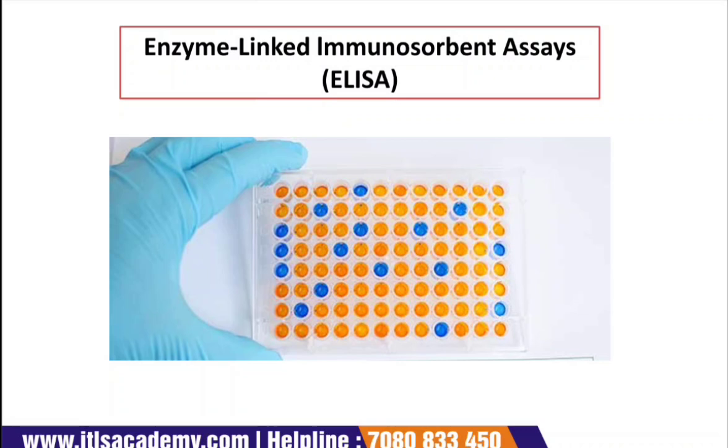By binding antibodies to the allergen and then using an enzyme linked conjugate to create a colorimetric change that can be measured. Or you can simply say that the ELISA method is used in different food industries because of its certain benefits and characteristics.